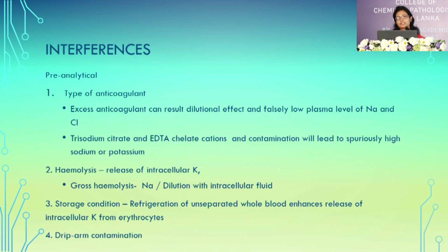Hemolysis also can increase serum potassium due to release of intracellular potassium. And gross hemolysis will lead to hyponatremia because of the dilutional effect. The storage condition is very important because refrigeration of unseparated whole blood enhances release of this intracellular potassium. So it can lead to hyperkalemia.